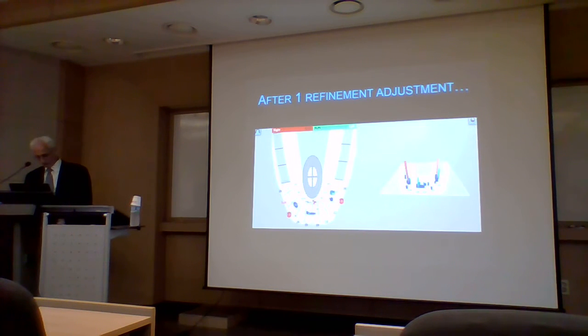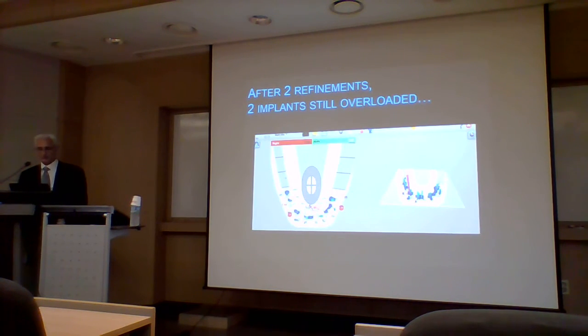So this went through the same kind of corrective sequencing, and still after treating these areas, there's still implant overload, and this is the beauty of the T-scan. It shows you that it's not corrected yet.